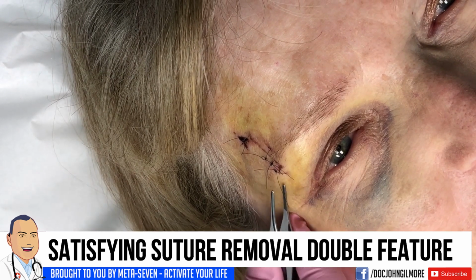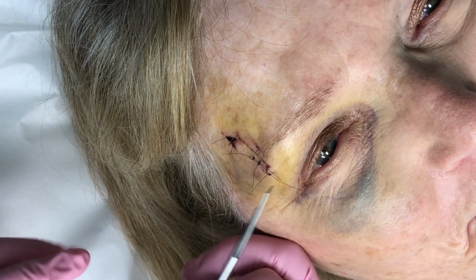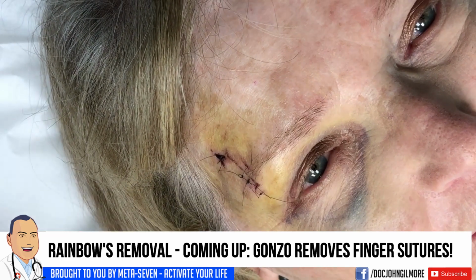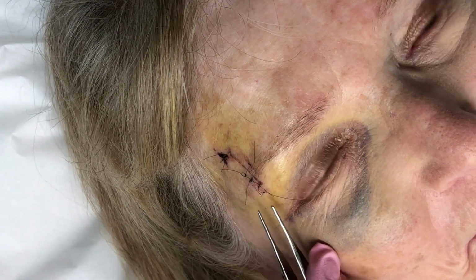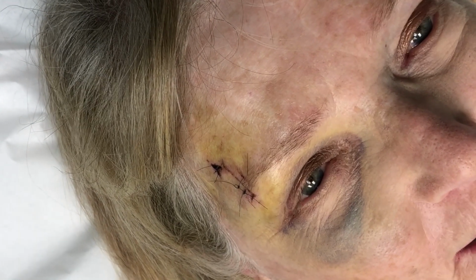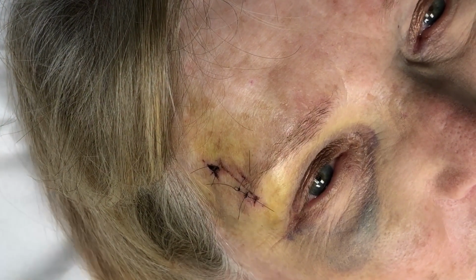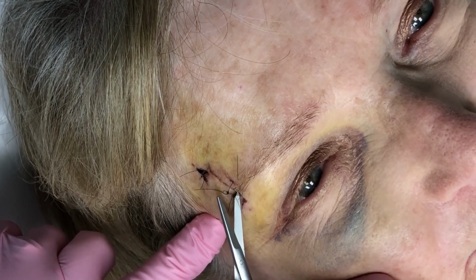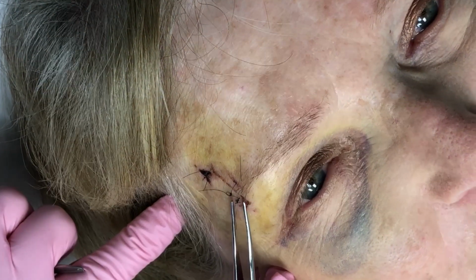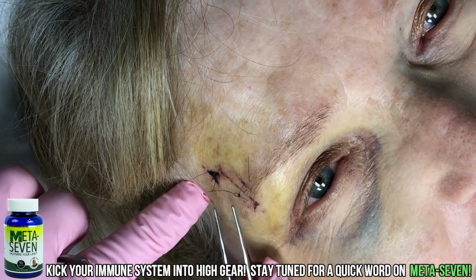We have Miss Rainbow, who had a tennis accident, right? Right, okay. Fortunately, despite the fact that there was a pool of blood left on the court, I understand, she just needed a few stitches above the right brow. Correct. So Miss Donna is going to take those out, and then we're going to put a few steri strips in place, right? Okay. Now, when this happened, did you lose consciousness or anything like that? No, never blacked out, never was dizzy or anything, so I was lucky, I guess. But I think my sunglasses did the damage here.